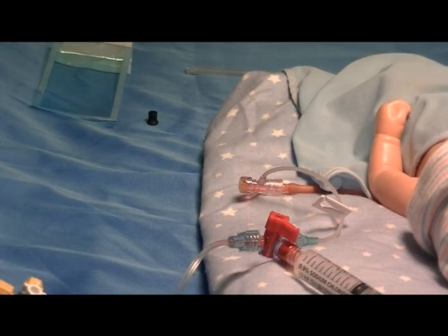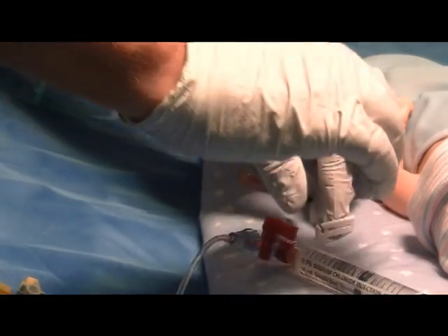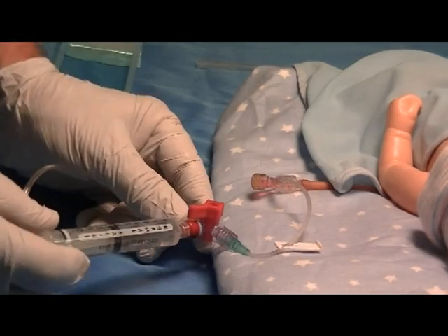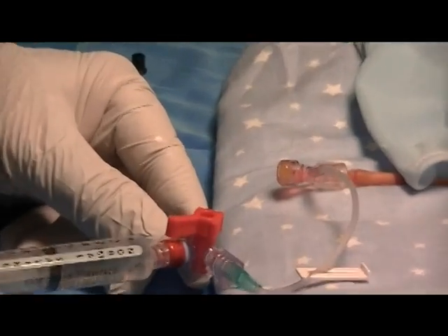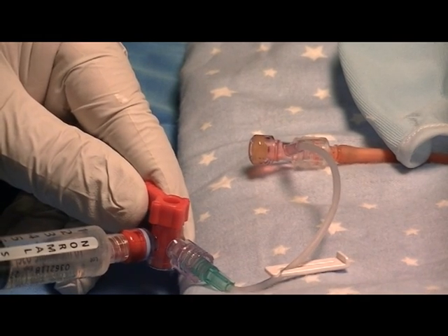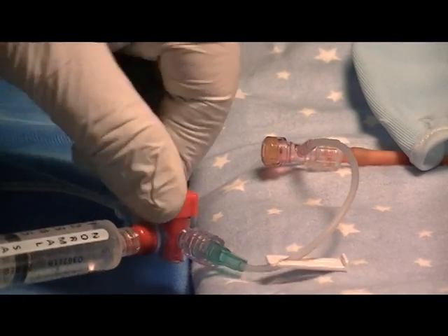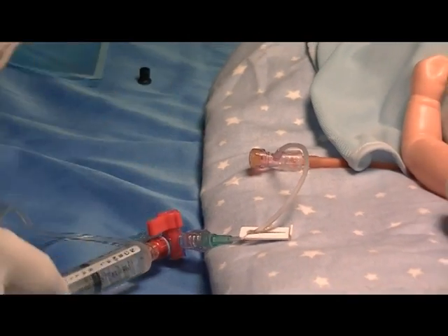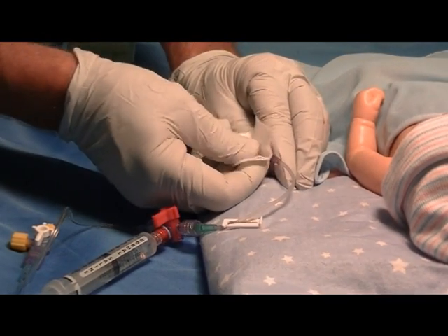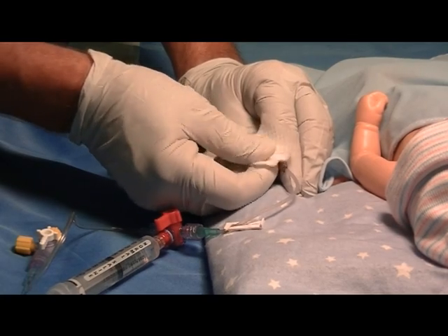Next, go to the line, unclamp the T connector to flush the line, and give approximately 0.5ml of flush to flush the catheter of blood. Then go back to the T and swab it to remove any residual that might be present.